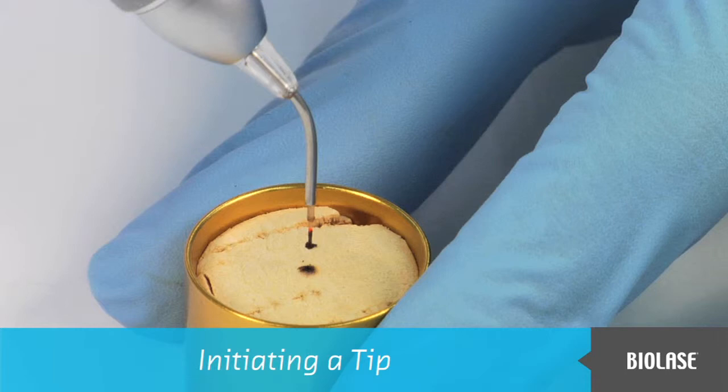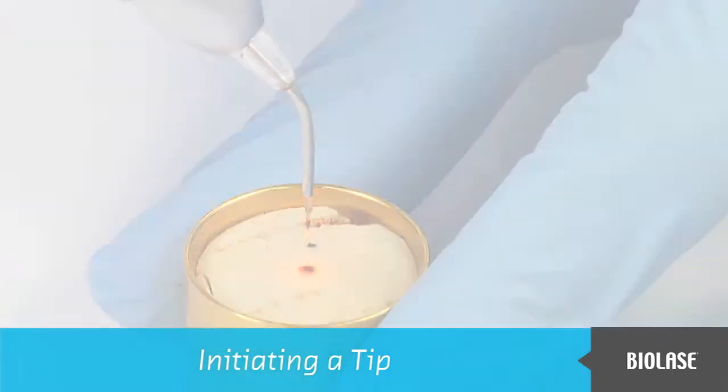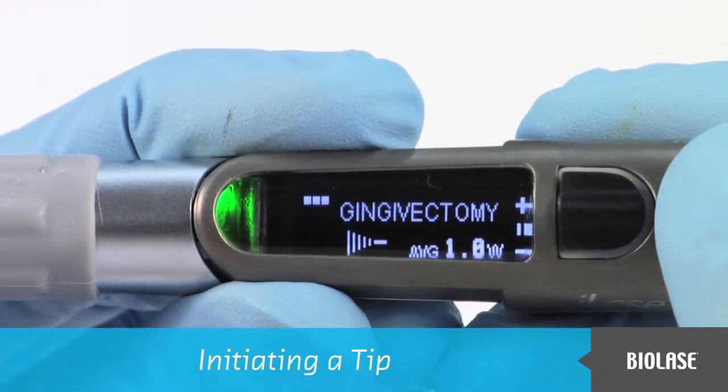Fire the laser quickly into the air once. The tip should glow yellow-orange. During a procedure, there is a chance that the tip might lose its initiation. Repeat the tip initiation procedure if necessary. After tip initiation is complete, press in the navigation button once to continue with your procedure.